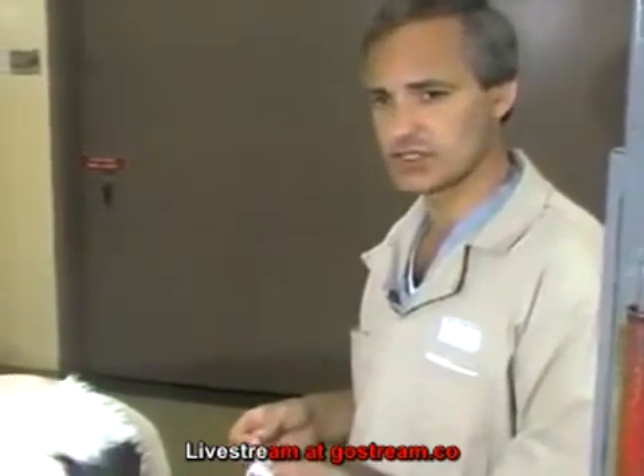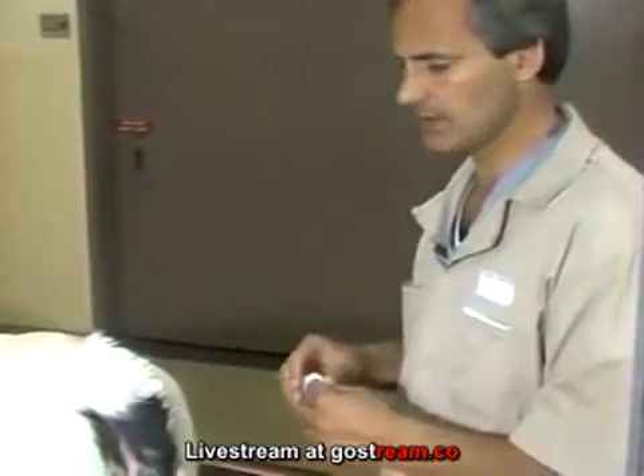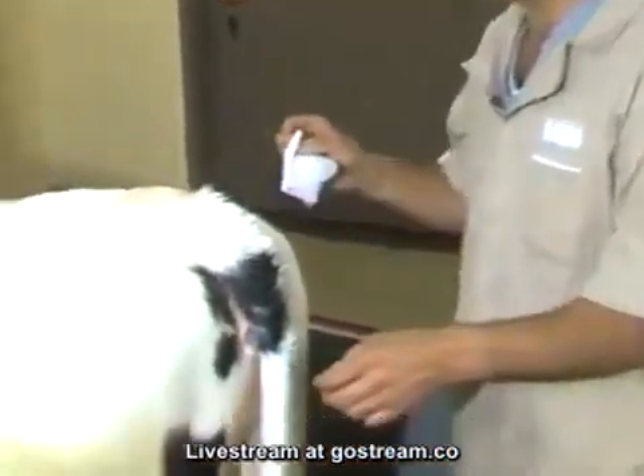I'm going to demonstrate epidural anesthesia. This is a very commonly used technique in cattle practice and has many uses.